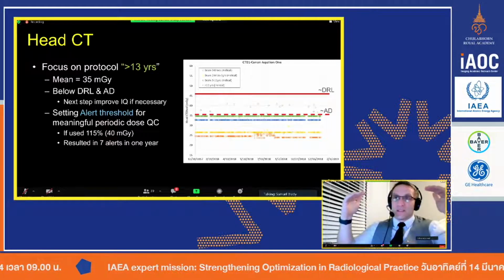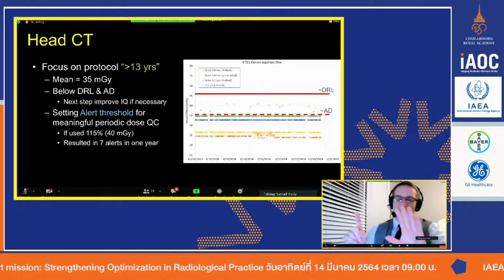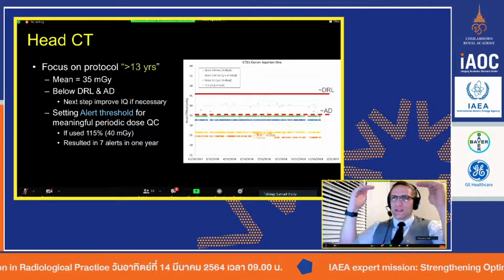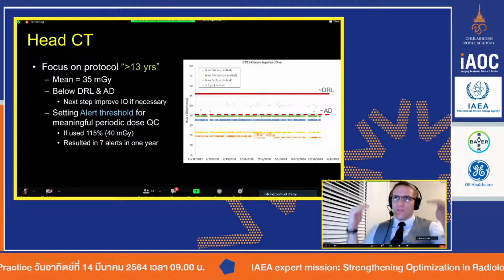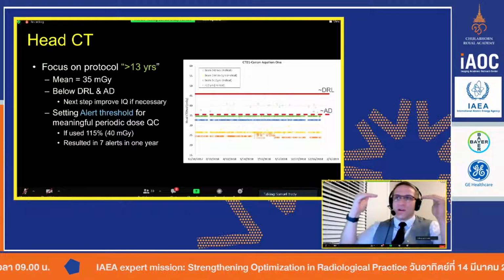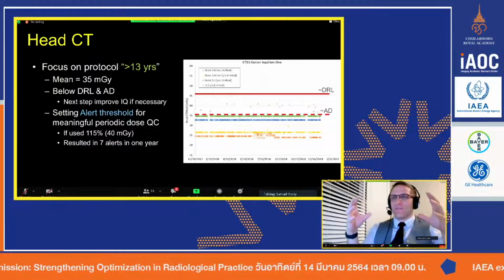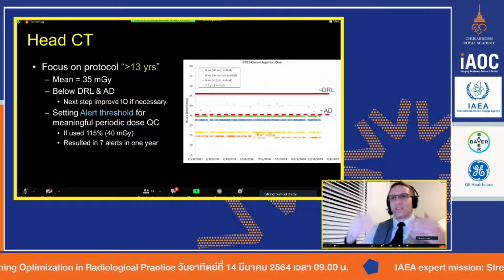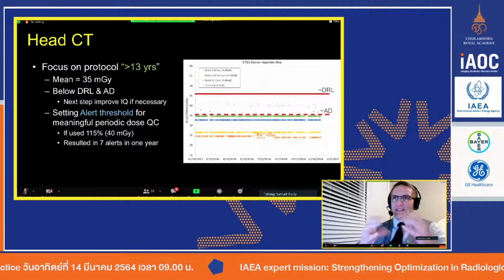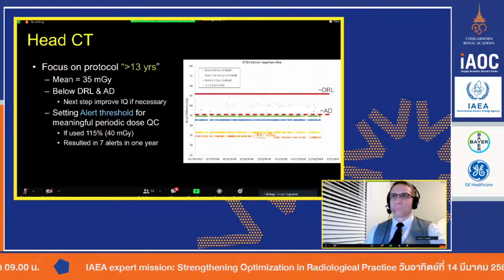And for a very busy hospital, or a hospital like yours where maybe you share a radiologist and share a physicist, then maybe it is good to have that really upper level, because then they will get email notifications immediately. Even a key radiologist, like a chief or an optimization radiologist, will get that email. They might not even be on service that day, but then they'll go, oh, something happened, and they can jump in. So you can do it, but let's be honest, a lot of the time the CT scanner itself will catch a lot of those issues and let you know about it. Okay, that makes sense.